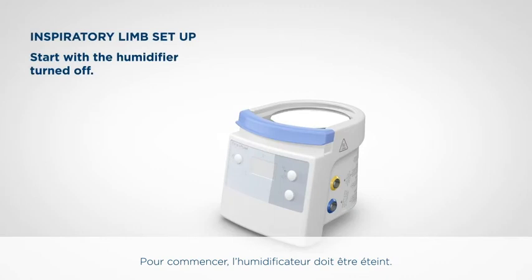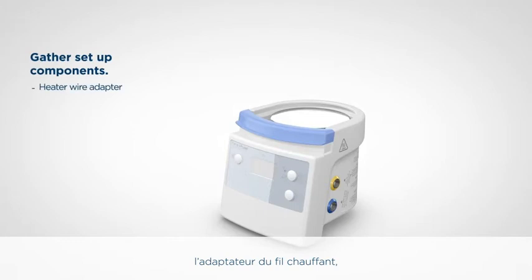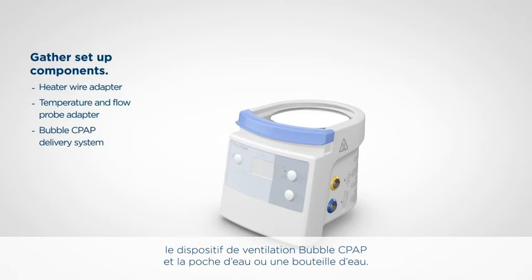Start with the humidifier turned off. Gather the components required for setup, including the heater wire adapter, temperature and flow probe adapter, Bubble CPAP delivery system, and water bag or bottle.